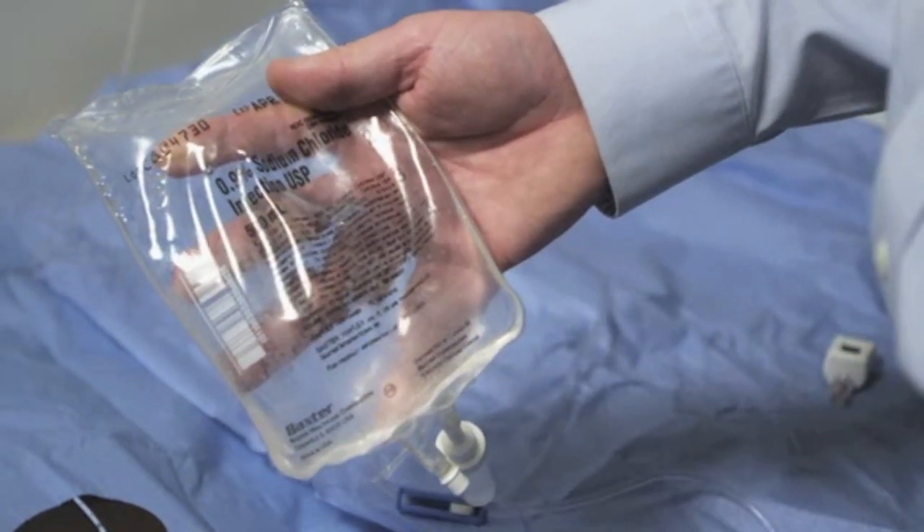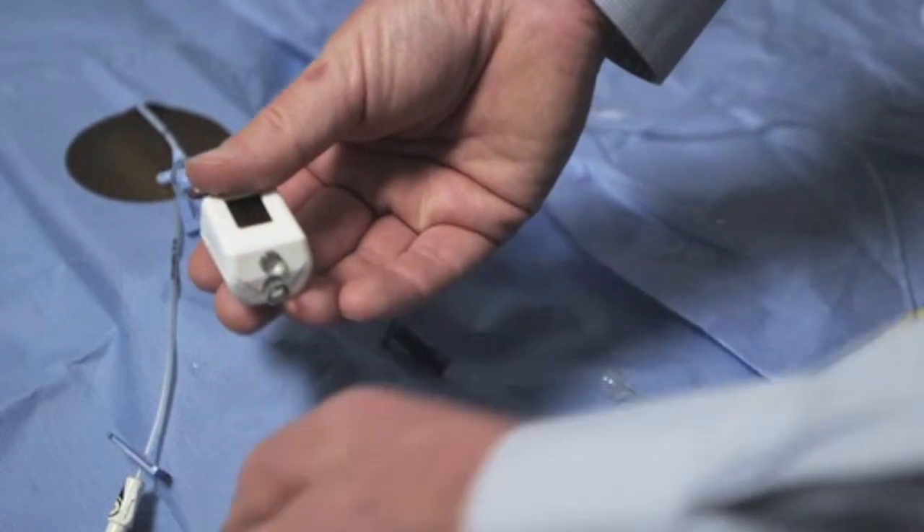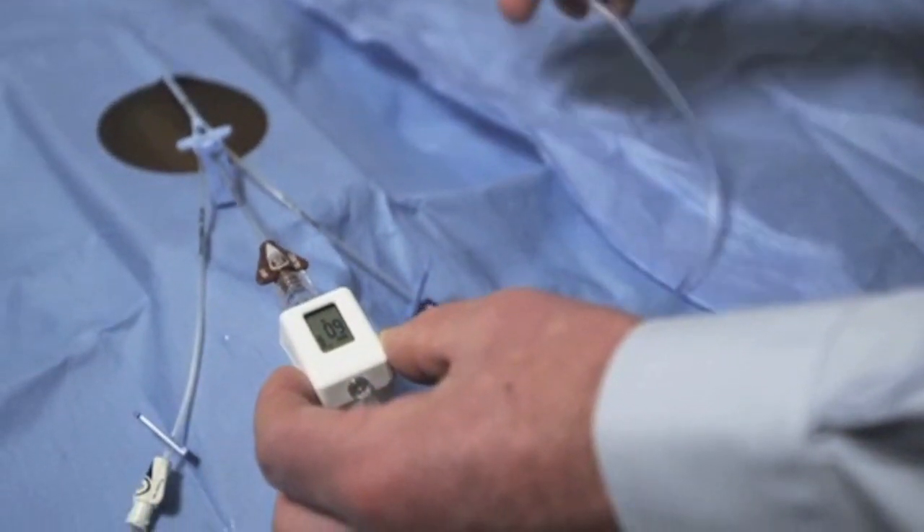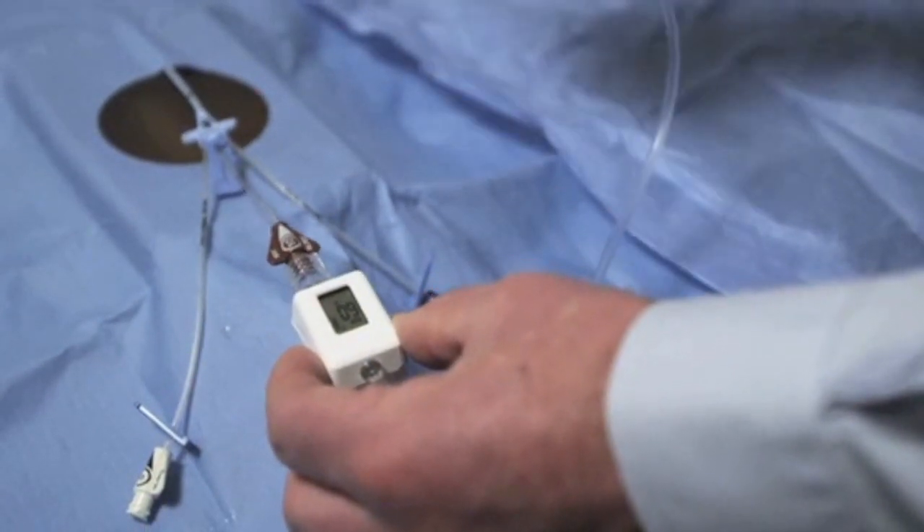In order to do this, the rear cap of the device is removed and then the fluid is infused through the Compass device into the central venous catheter.